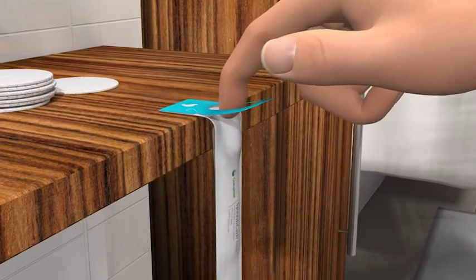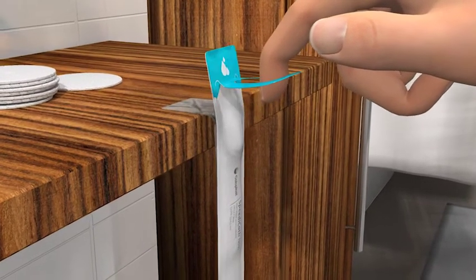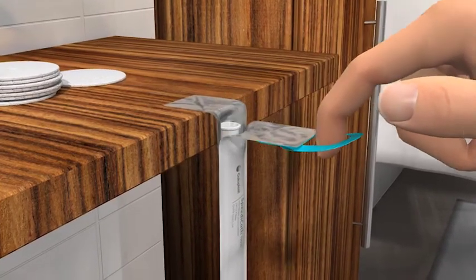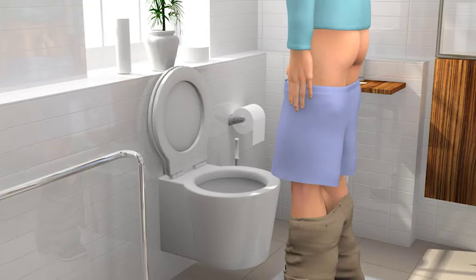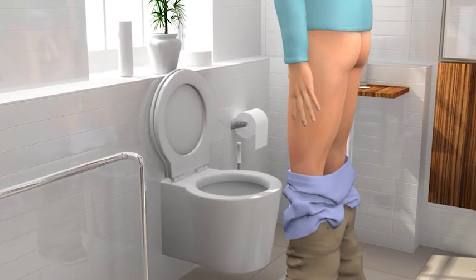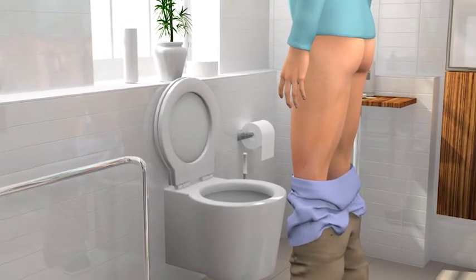Open the upper end of the packaging by pulling the ring towards yourself and then downwards. You can also open the packaging without using the ring, but do not open it using your mouth. To avoid spilling the liquid inside the package, stop pulling as soon as you see all of the turquoise insertion grip. Pull your clothes down so you have free access when doing the catheterization.